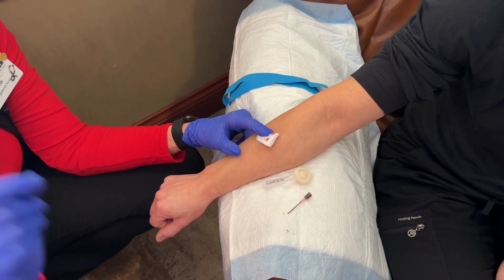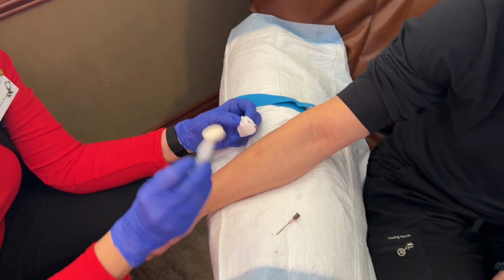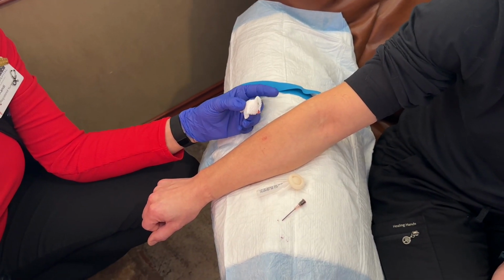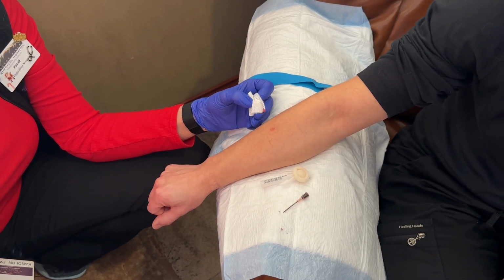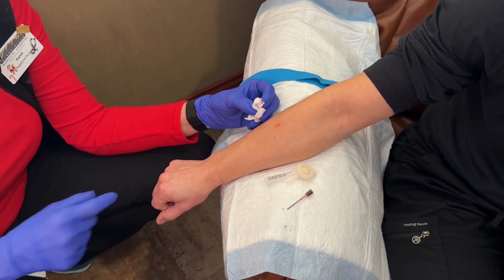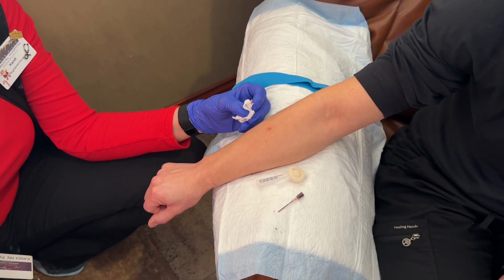It is instant onset. By the time I was done injecting and I re-wiped her arm just to give a little cleaning to it, and put the IV in, it was probably 10 to 15 seconds at the most, and it was already completely numb. It will numb within less than 5 seconds, 2 to 3 seconds. While you're injecting, believe it or not, even though they might have that little bee sting because you're still injecting, it's numbing at the same time, so it's usually numb within 5 to 10 seconds.